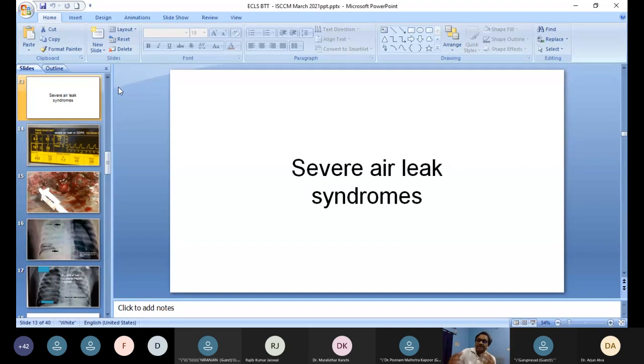The other way is if the patient has come in suddenly and you want to look at the airways before you decide about the transplant itself. You want to make sure there's no bronchomalacia, no growths in the endobronchial tree. This actually is quite useful in patients with ECMO. You would otherwise not be able to do if they were on just a conventional ventilator.